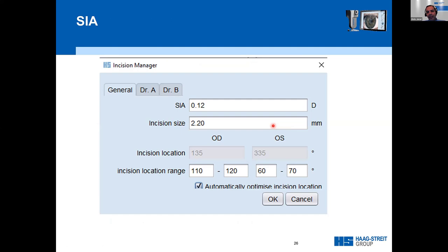It's fundamental for toric planning to have the surgical-induced astigmatism, incision size, and incision location. These data should be entered into the iSuite incision manager so the software can optimize the toric plan. There are online calculators to calculate surgical-induced astigmatism — this is a unique value for each surgeon depending on their technique. Incision size and location are known parameters, and we can also use a range for incision location, letting the software optimize the best location for the best outcome.